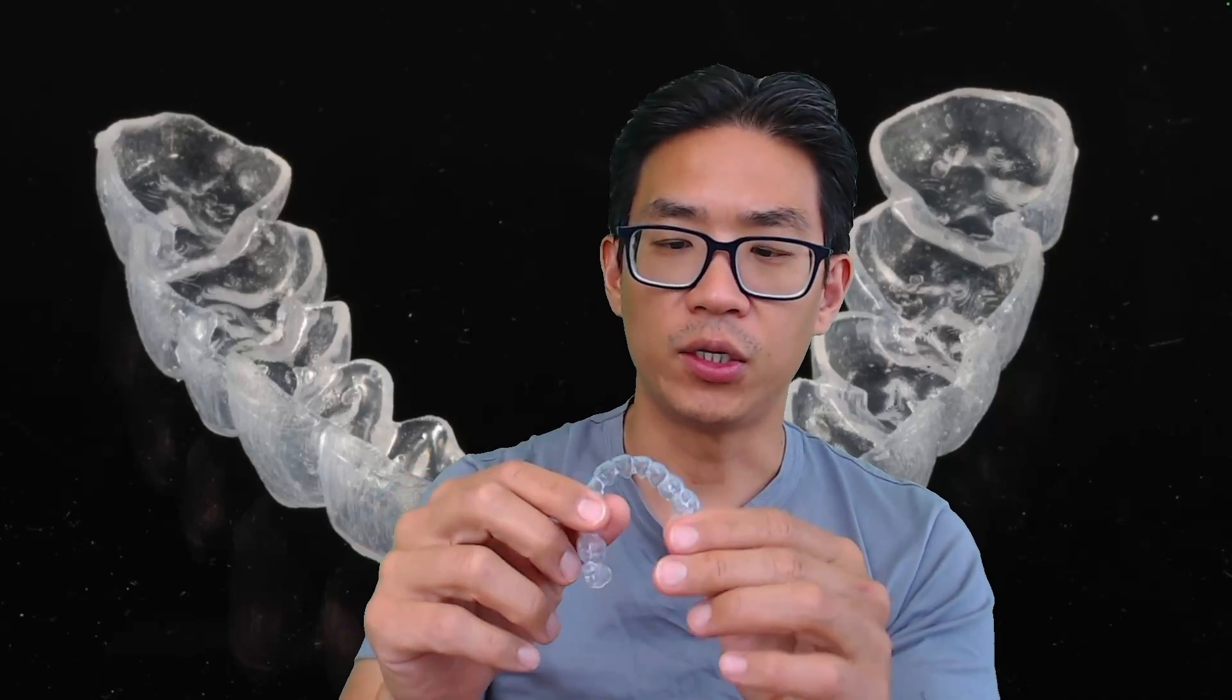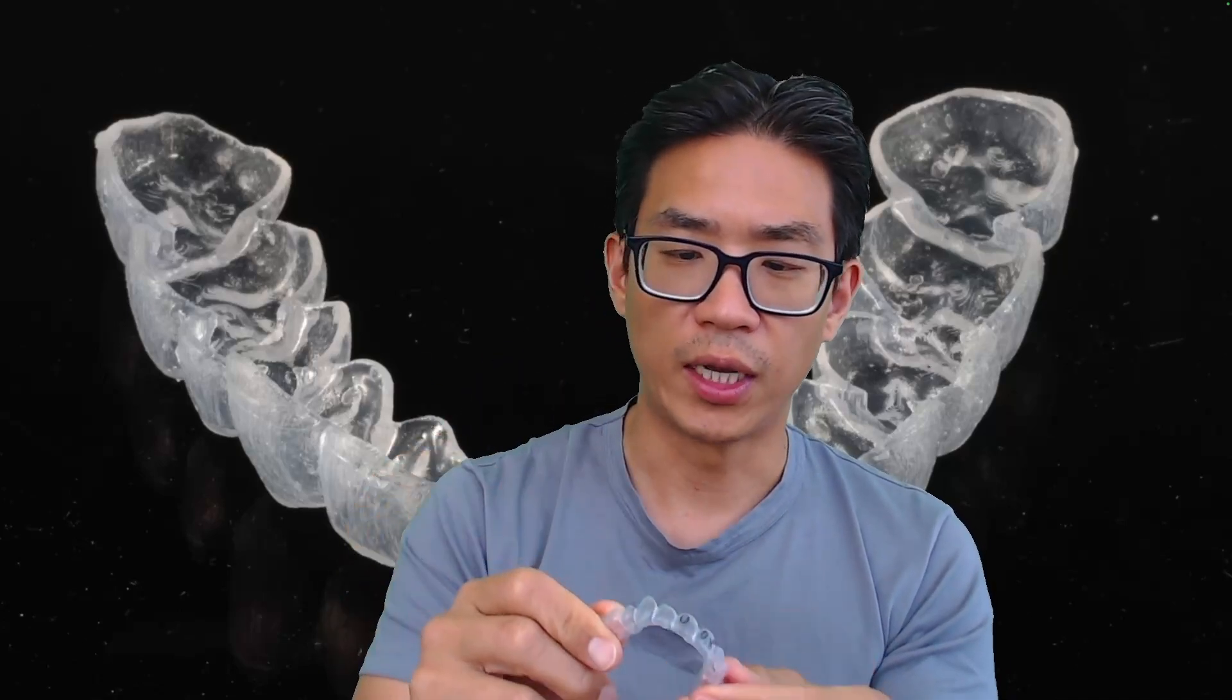In this video I wanted to show you how to design whitening trays or fluoride trays so that they could be 3D printed using Keysplint Soft, which is what I use. There's a conventional way of doing vacuform, but this is just to show you that it is possible with 3D printing.